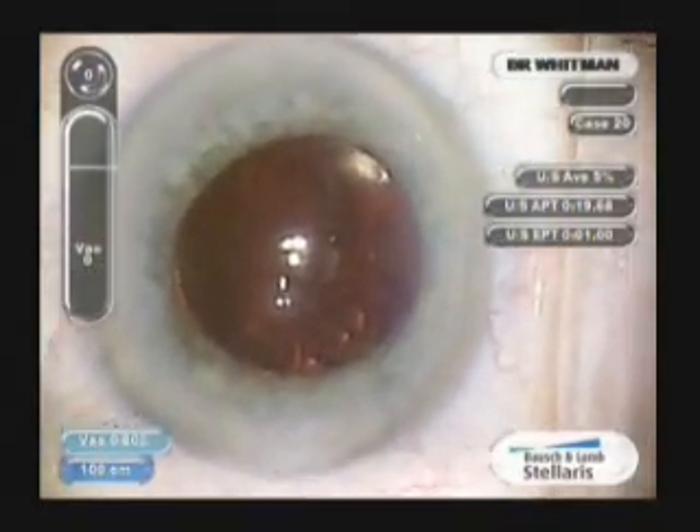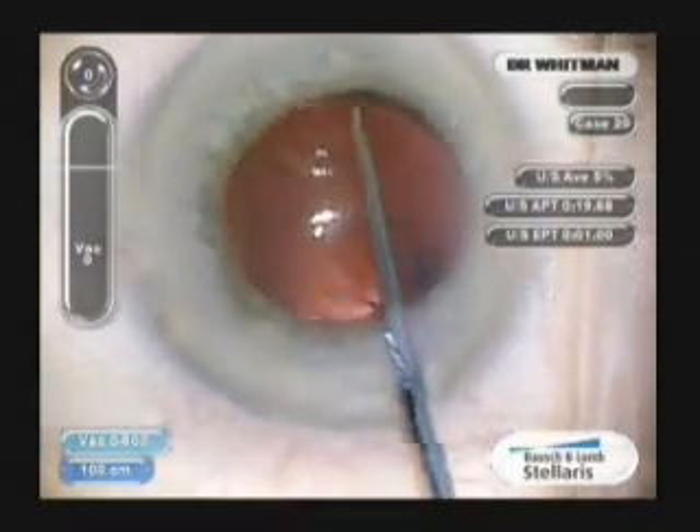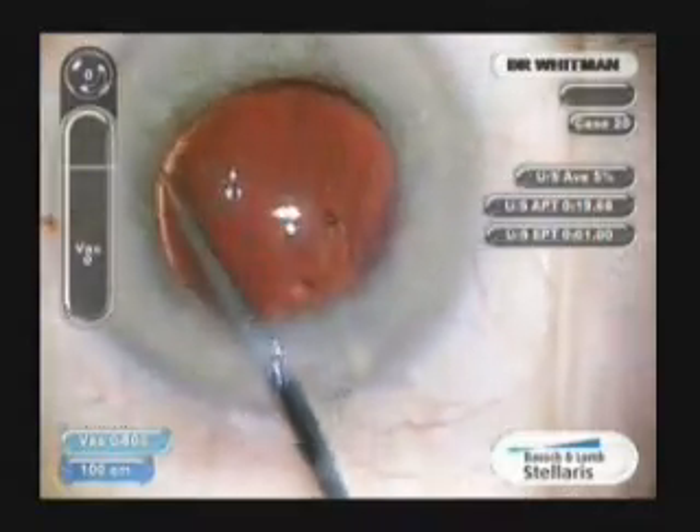The lens can then be turned in any direction, and you'll see the lens self-centers extremely well.